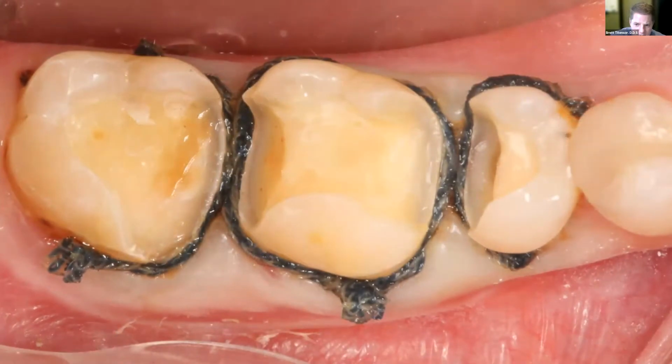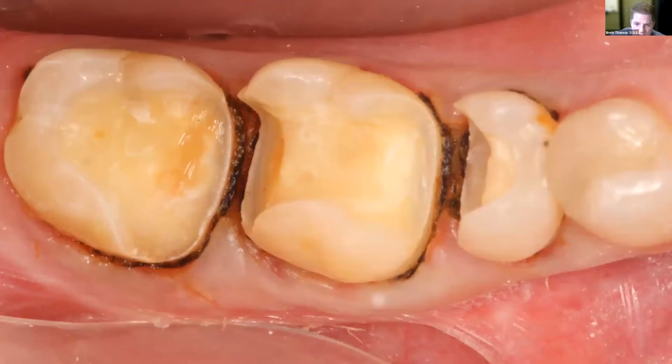So here's an example of a case that I did where I was doing 3 inlays and onlays in a row, but this is showing the 2 cord technique. So this is with my second quad. I'll put the first 00 cord in and then a second size 1 cord over the top. And then right before I'm about to scan the case, we pull that top cord so you can see a really nice, good separation between gingiva and tooth structure.